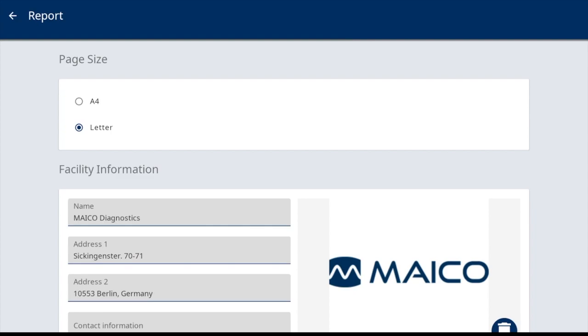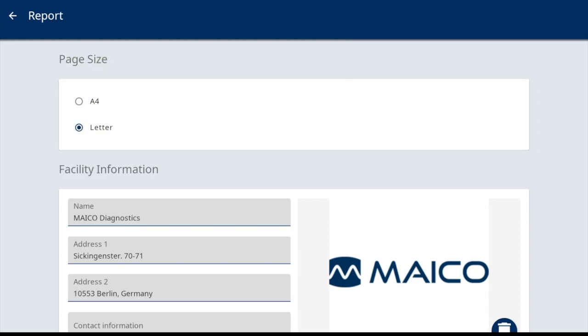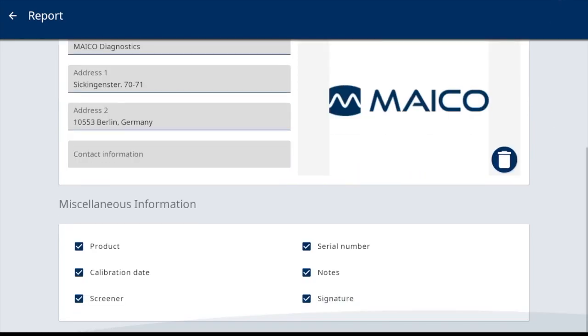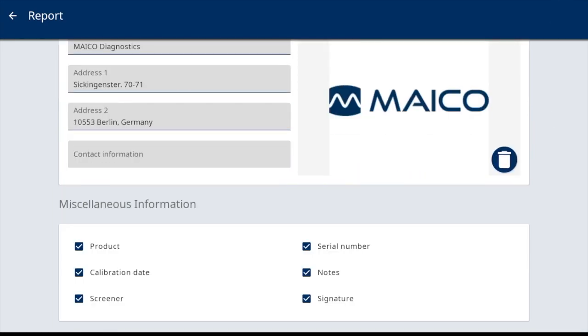Other report settings for review include page size. This is to make the selection according to your default paper size. And miscellaneous information. This list includes optional information that will be displayed on the PDF reports. The selections are defaulted on, but for any information item you do not want to have printed, deselect.